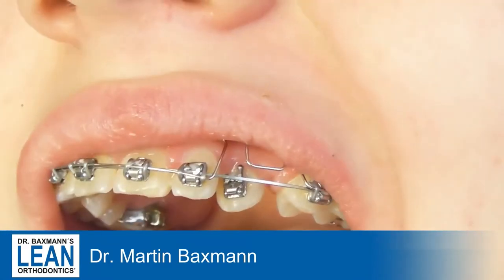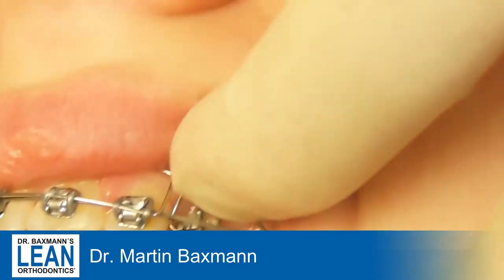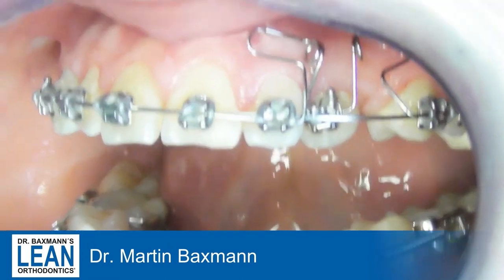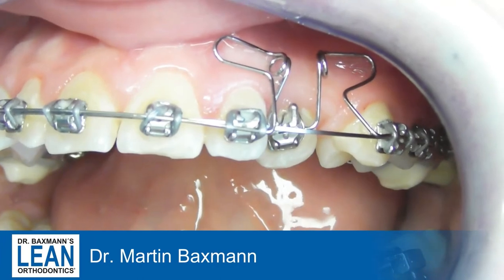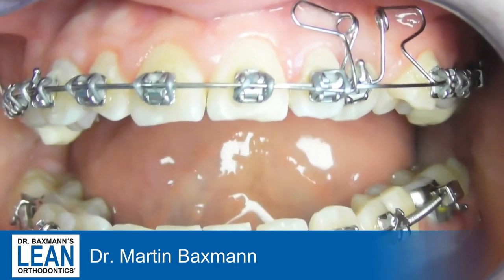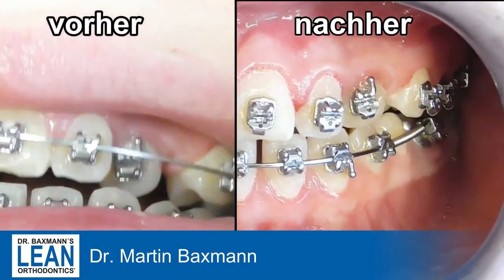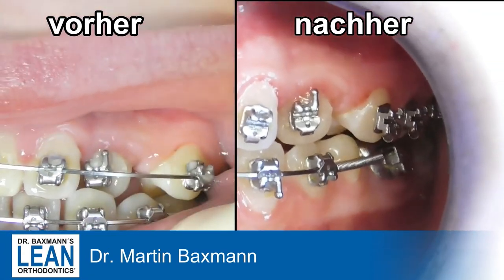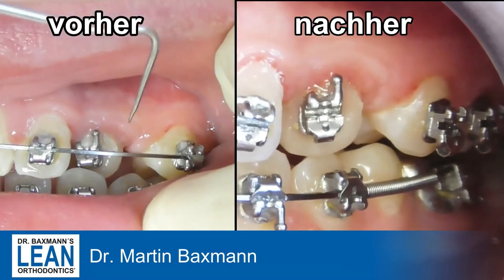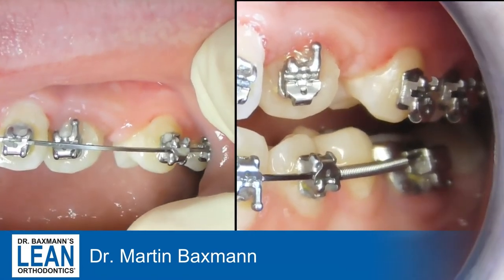Put it in, activate it, and now put it in your self-ligating brackets. That's really helpful when you have a self-ligating bracket — if you had to put it in with extra steel ligatures it would be really complicated, so it will work nicely. Now leave it for about four to six weeks and see how it goes. And as you can see, that's the very next appointment — we have already come across the lower four, so the crossbite is corrected. Obviously it's not completely leveled, but that's what we'll do soon.